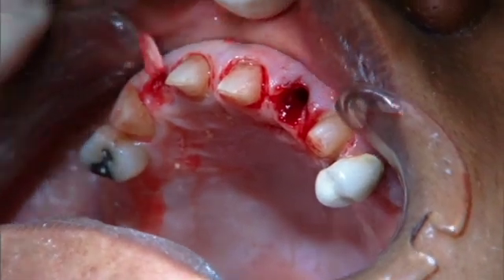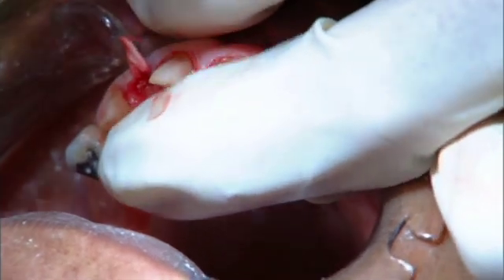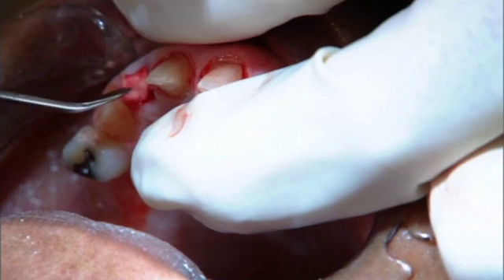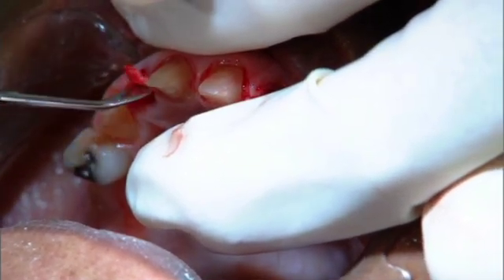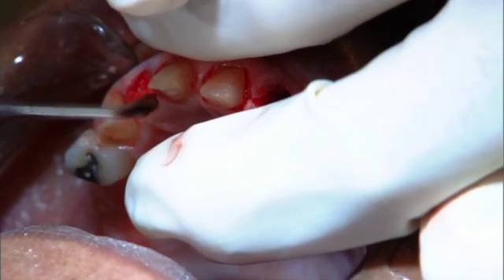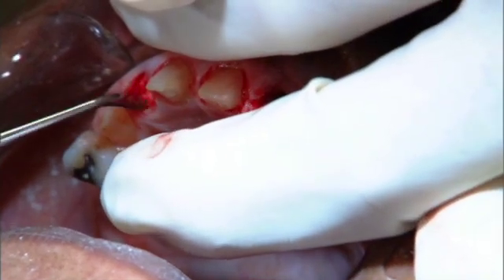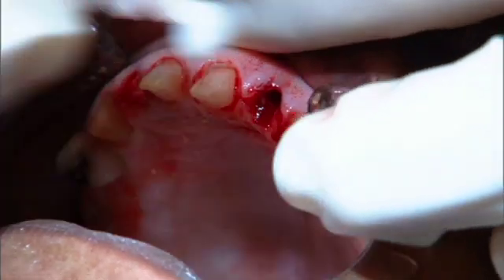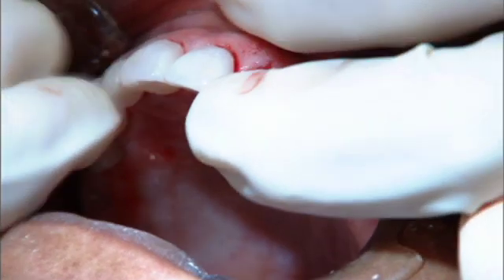This is part of the reason that I prepared the teeth first, so that my little surgical site, my little graft site would not have tooth dust and debris all down in it. I can then just fold that over like a little manhole cover and provide a barrier. I can then try my provisional in and see that I'm putting nice pressure on that.